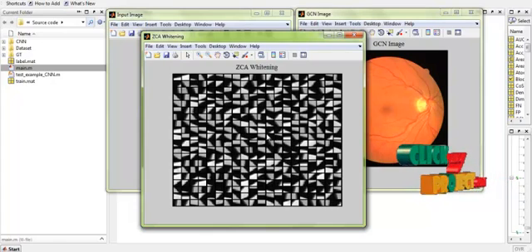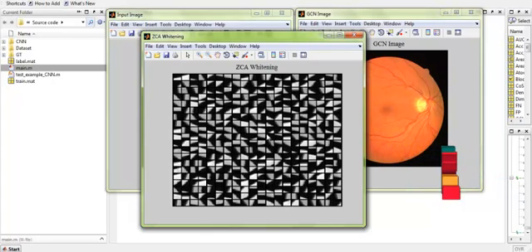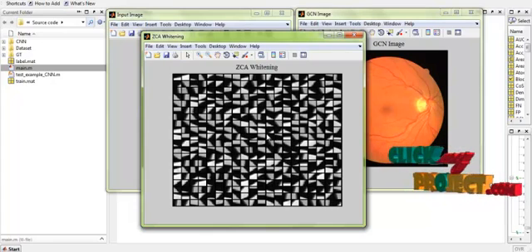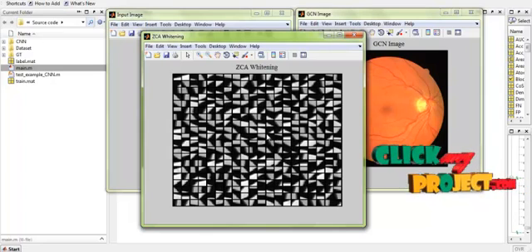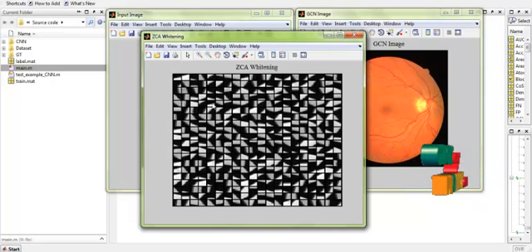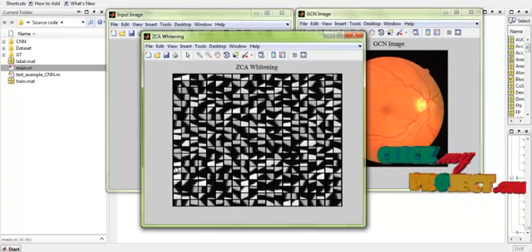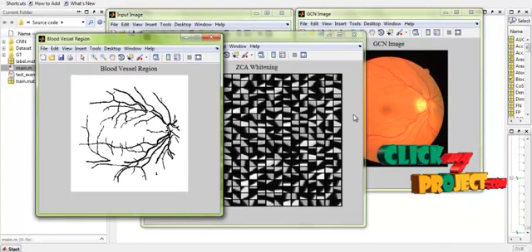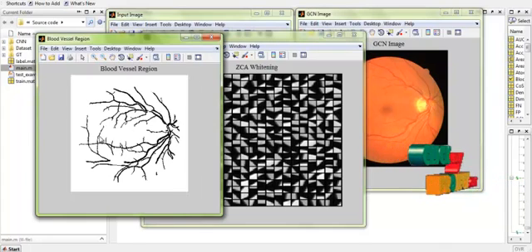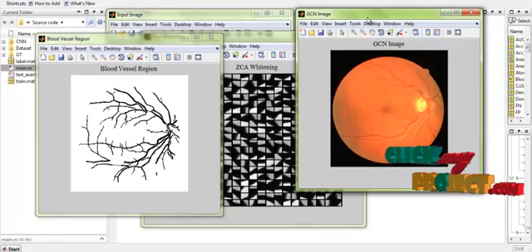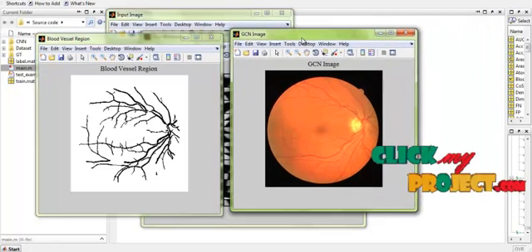In this step, the patches of the input images are separated in randomized order and the whitening process is applied. As we can see, this is the segmented blood vessel regions extracted from the input image.